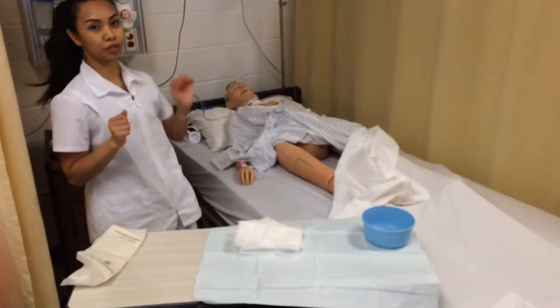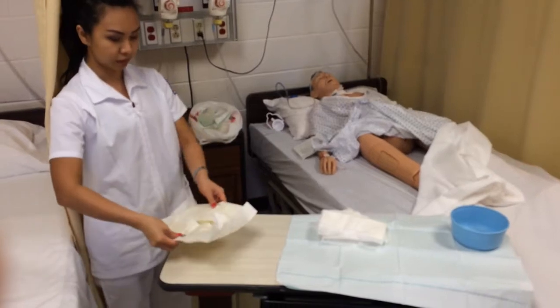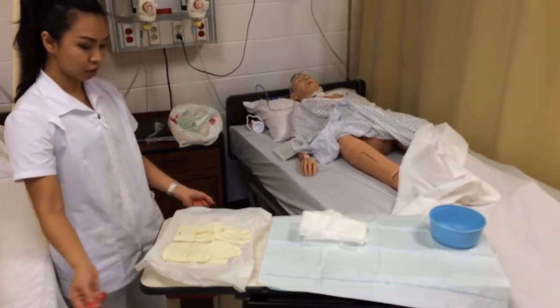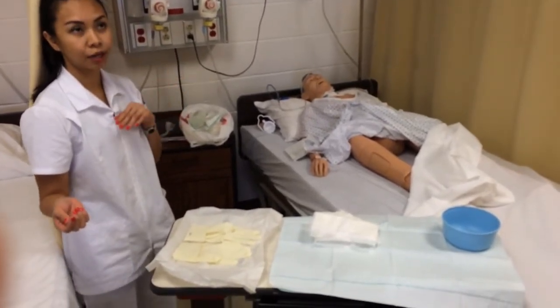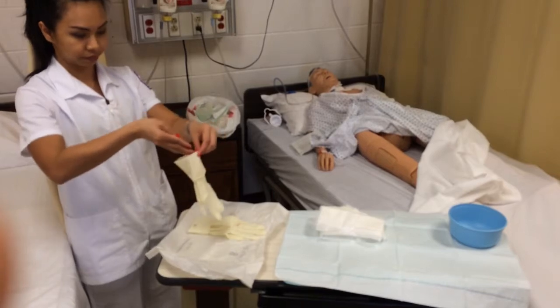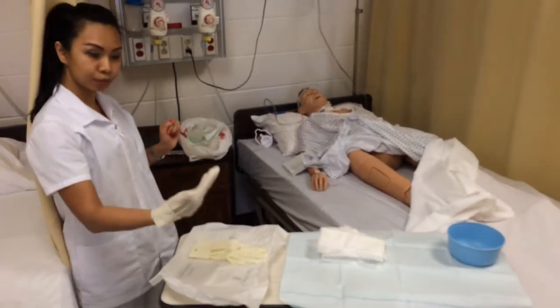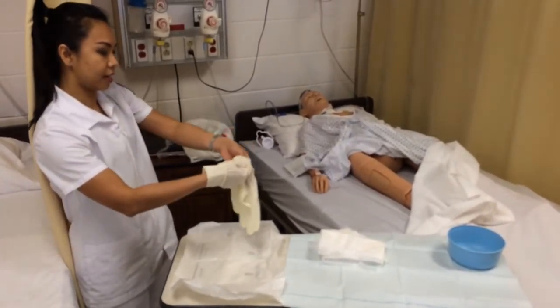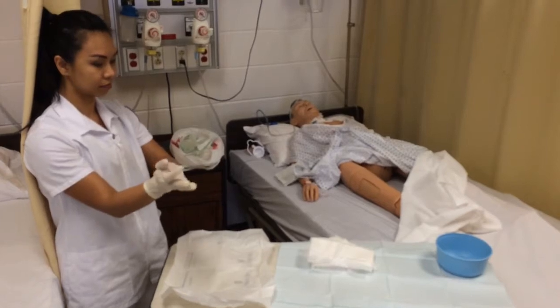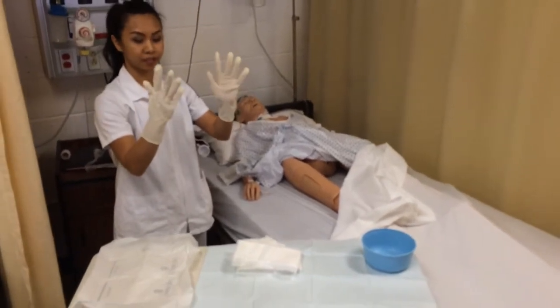Then I put the sterile gloves on. I step to the side, open the package, and put on my dominant hand first. Then I use my gloved hand to slide under the cuff and put on my left glove. I fix the fit and make sure my hands remain above my waist so they are not contaminated.